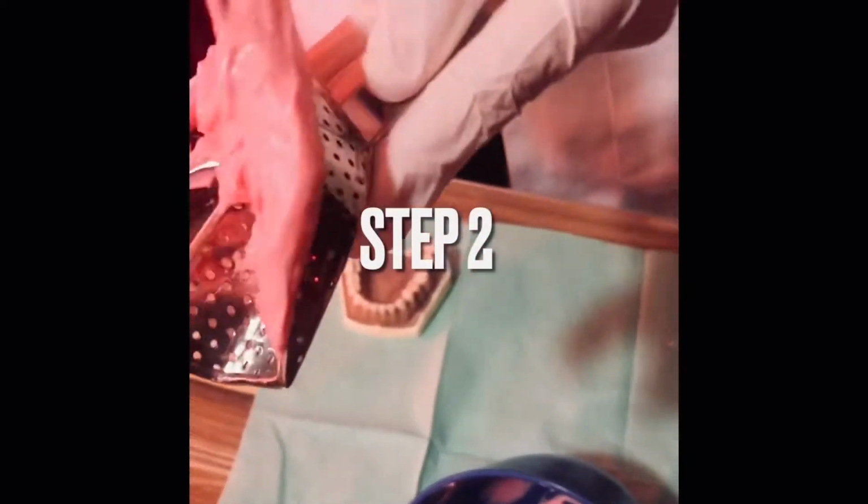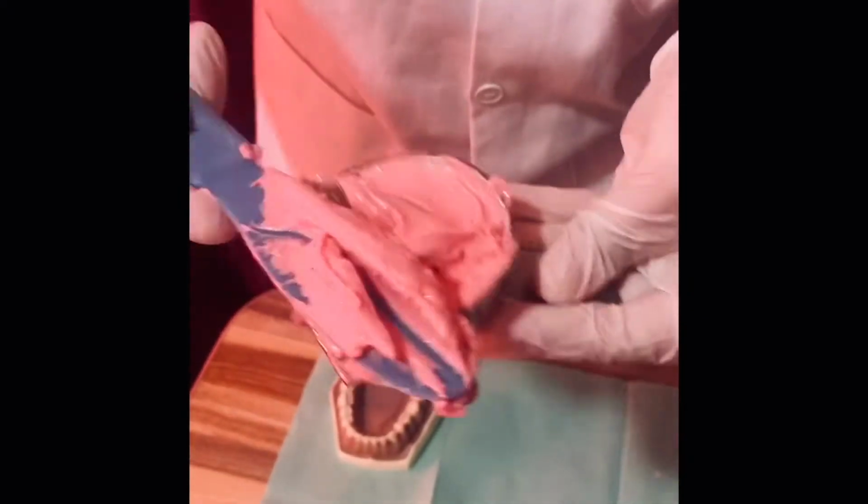Mix 2 nice scoops of alginate powder with an adequate amount of water, then stir in the powder. When it's covered, put lots of motion against the sides of the bowl to make sure all the powder is mixed in. When the mix is ready, take 1 scoop with your spatula all the way around and load it on your tray, as you see in the video.